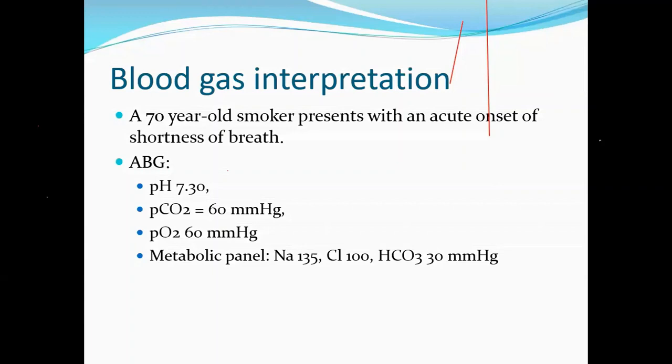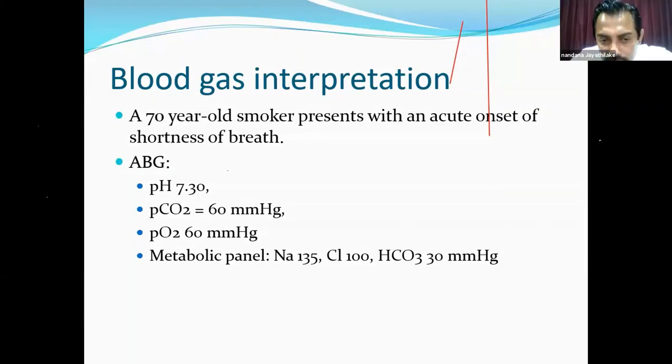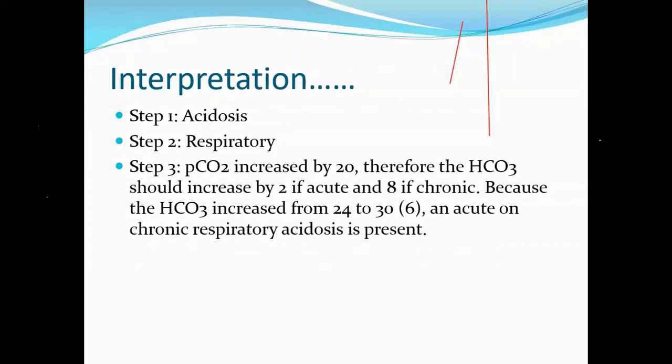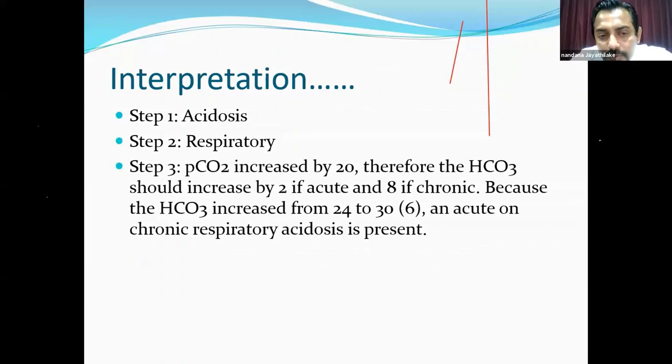So this is a respiratory acidosis partially compensated by metabolic bicarbonate. Partially compensated. Step 1, acidosis. Step 2, respiratory. Yes, respiratory acidosis.